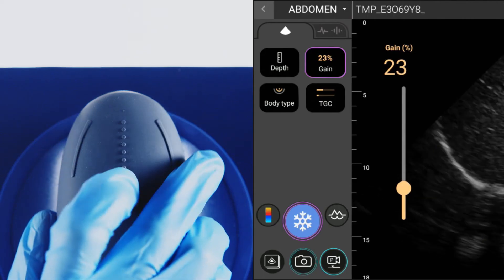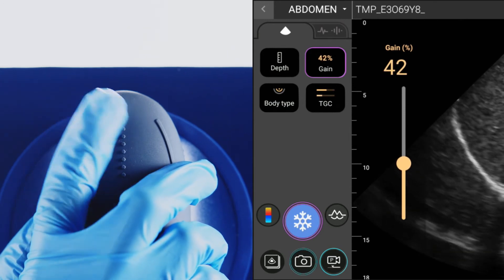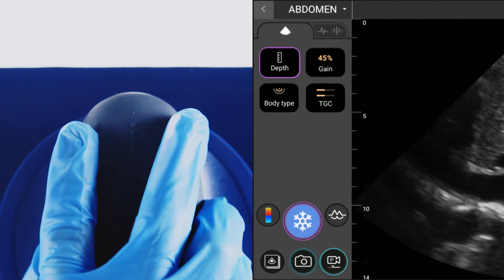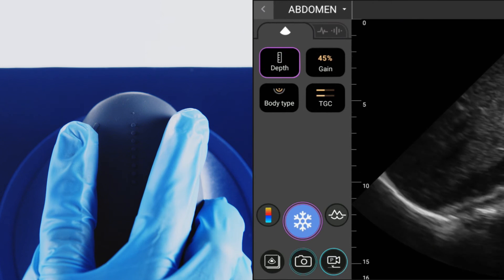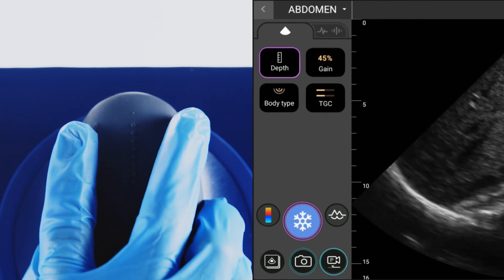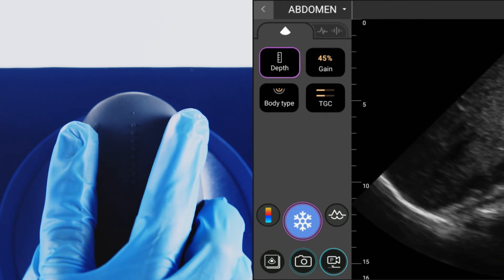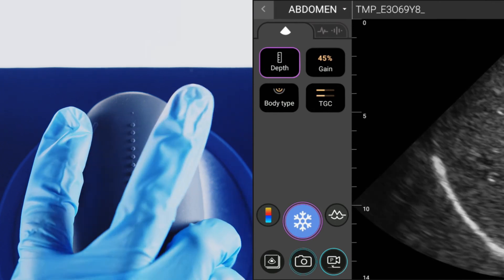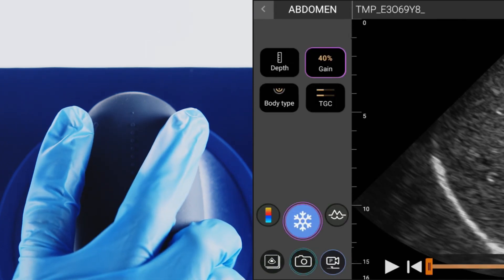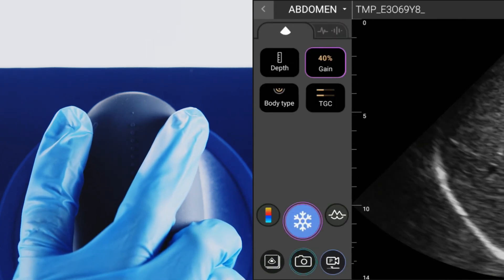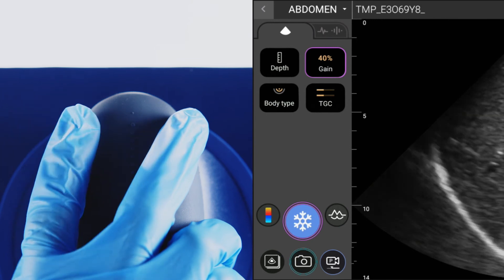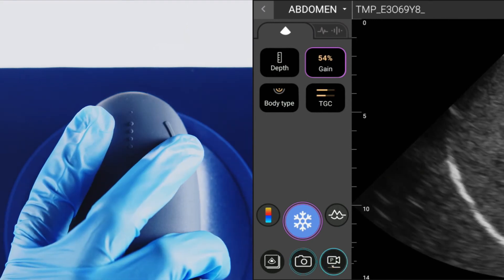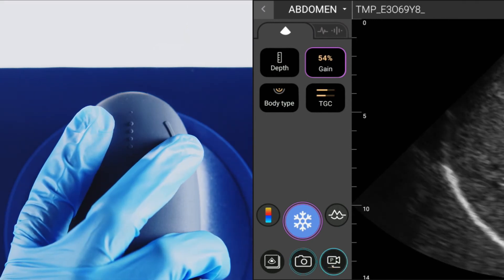The slider adjusts the gain or depth. A single tap to the button on your left — that is the left when looking at the bridge from the front — toggles the slider between adjusting gain or depth. A double tap on the left freezes an image. The right button is reserved for image capture: a single tap will capture a video and a double tap will capture an image.